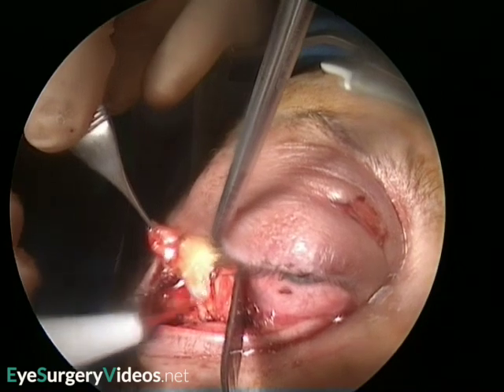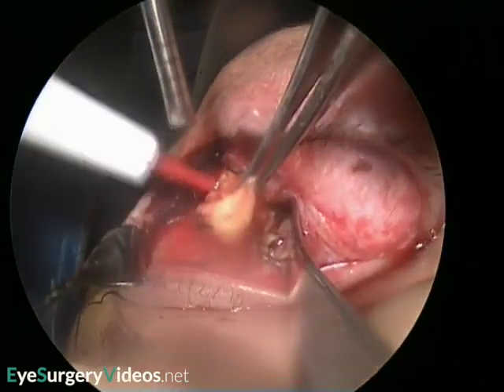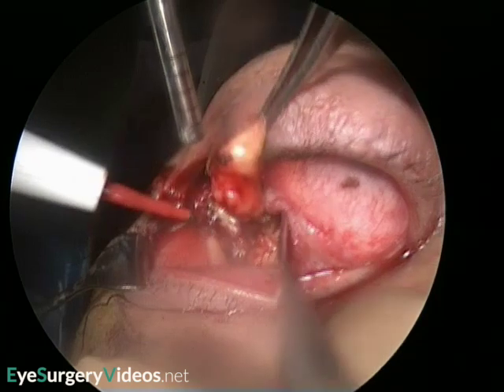The fat is removed very slowly, and often piecemeal, and is typically more fibrotic in patients with thyroid eye disease, and even more so in those who have previously had orbital radiotherapy. With a cautious fat decompression as you see here, around 2ml of fat may be removed, which results in around 1–1.5mm reduction in proptosis.